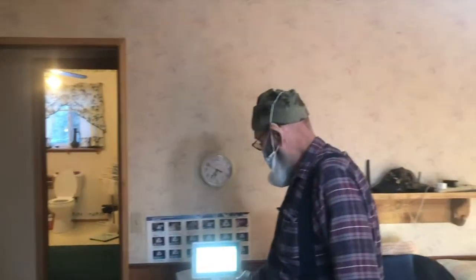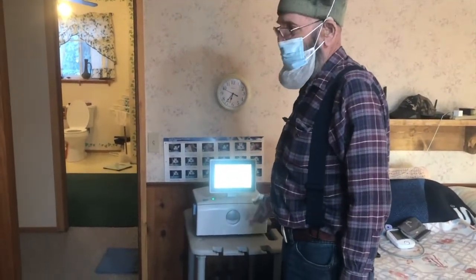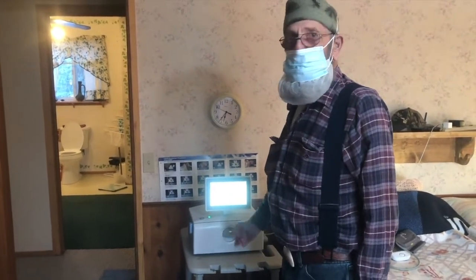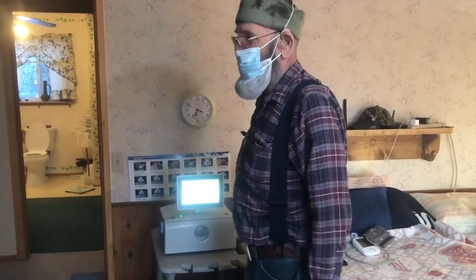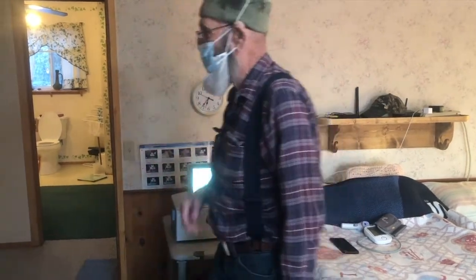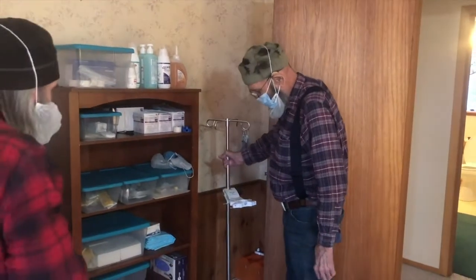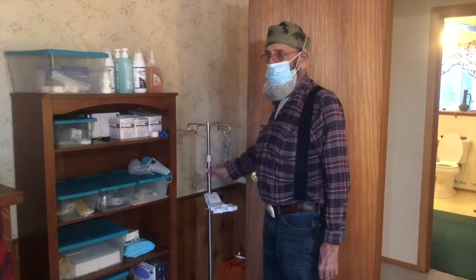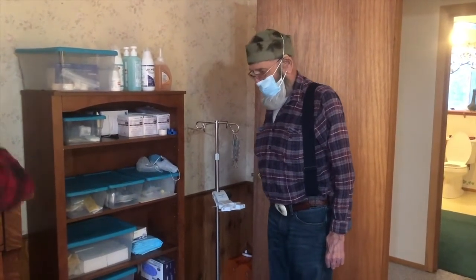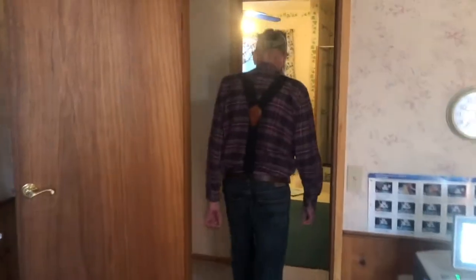And this is Alice, this is my lover. This is the one that does all the fluid transfers and all of that. It's all automatic. This one works really well. And this is, I call it my dancing pole. This is Alice, or Trixie. If we don't have power, this is the one I have to use for doing my transfers. So then I'm going to go in here and wash up and get ready to do this.